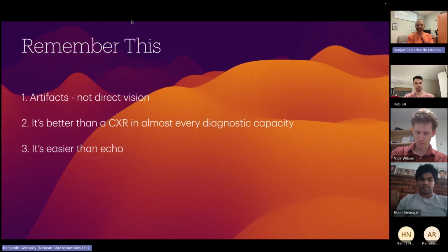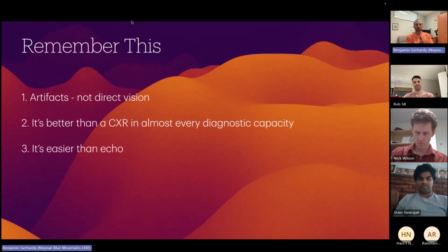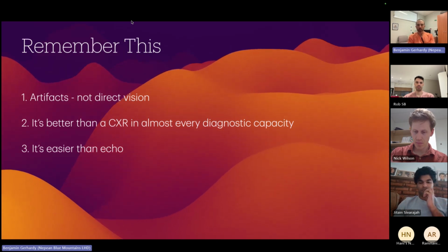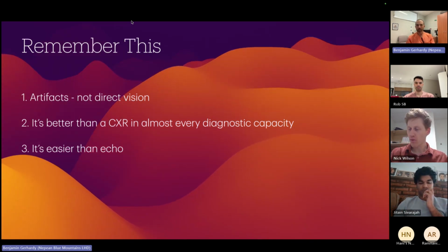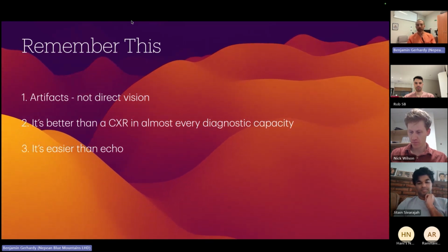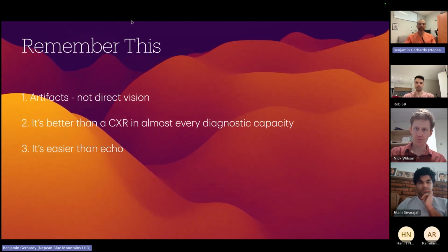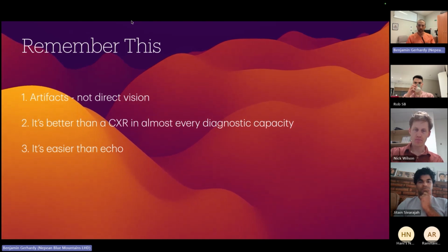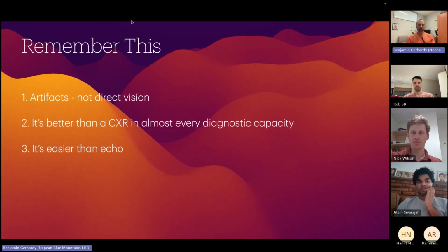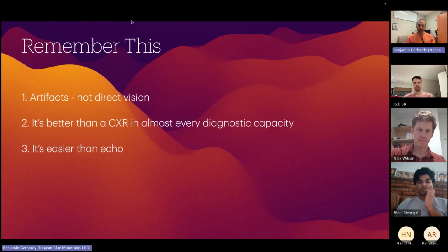As someone that sat the Viva twice, I'd say you want to absolutely know the fundamentals of this, not because you should expect to get asked complex questions about it, but because of the overlap of lung ultrasound with the rest of the DDU program, which is a lot of critical care echo, having people on a ventilator and being able to get them off, the evidence for using lung ultrasound to complement your assessment of left atrial pressure and weaning failure, not to mention some simple point of care things: pneumothorax, pleural effusions, pneumonias. So that's the principles of lung ultrasound being incorporated in this program.